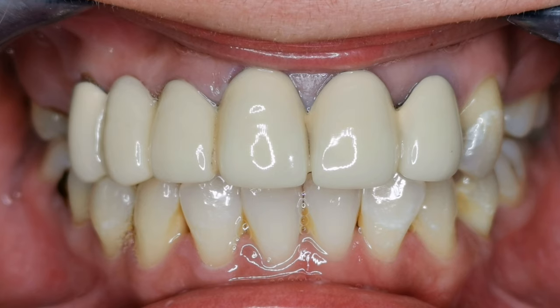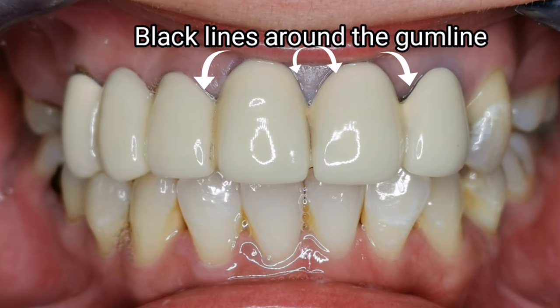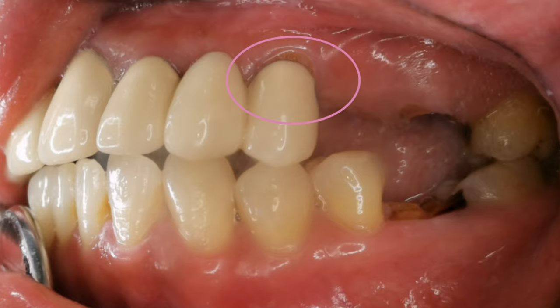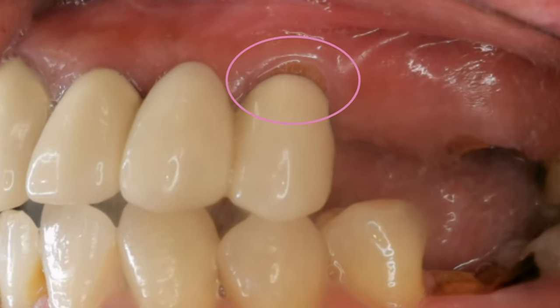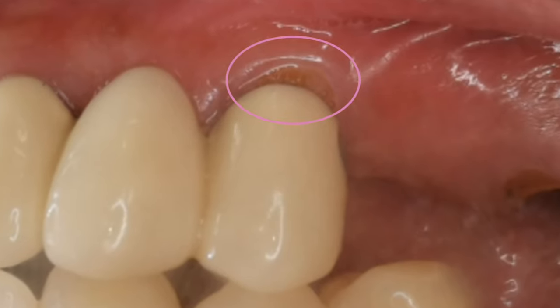This is her 10-year-old porcelain-infused-to-metal crowns. Here you can already see that there are black lines showing at the gum line, and there are discolorations in between the crowns. The color of the jacket crowns doesn't match her natural teeth, and you can see gum recession, which means the tooth structure supposed to be covered by the crown is already exposed and causes tooth sensitivity whenever she drinks hot or cold beverages.